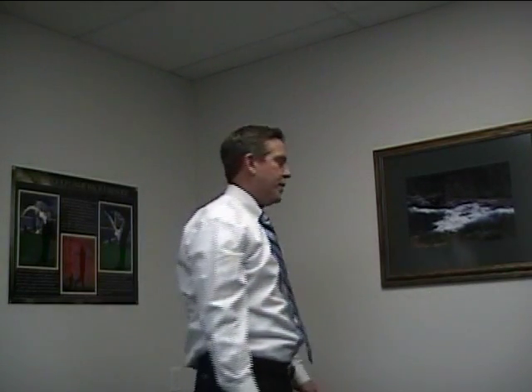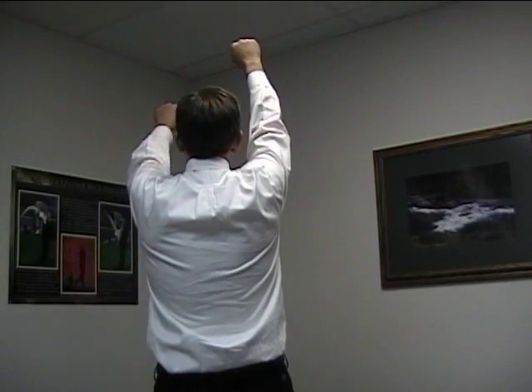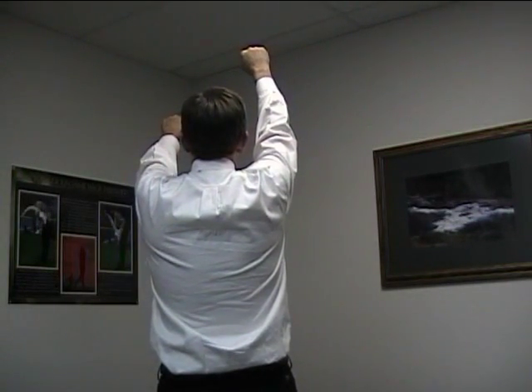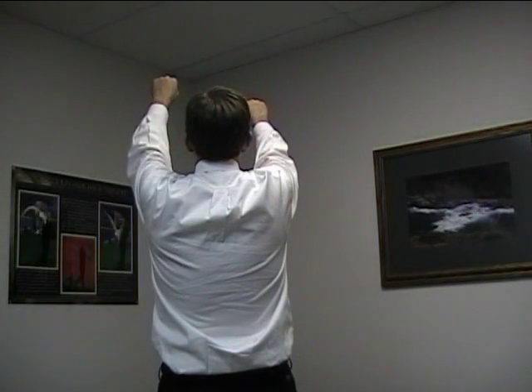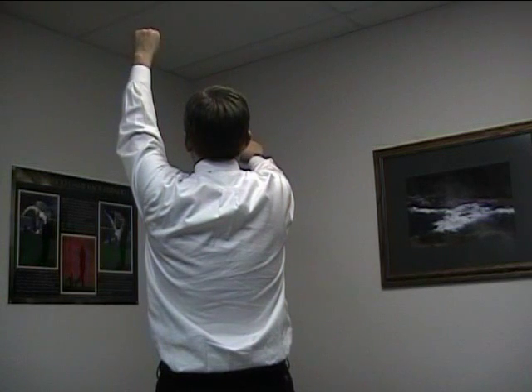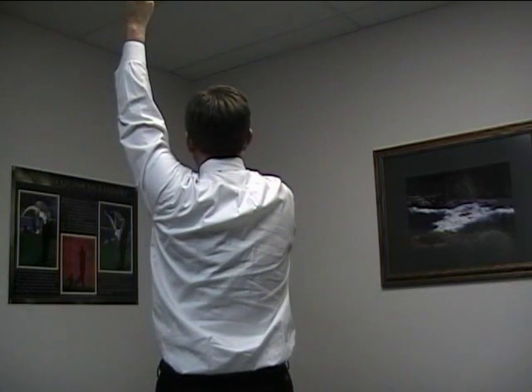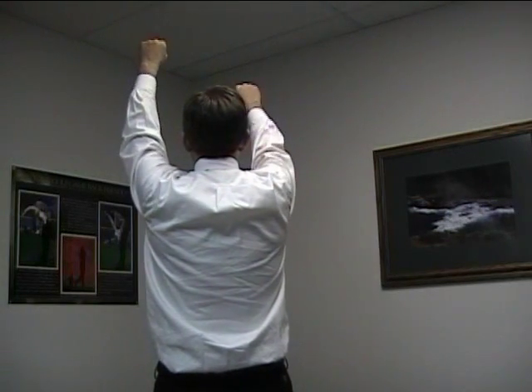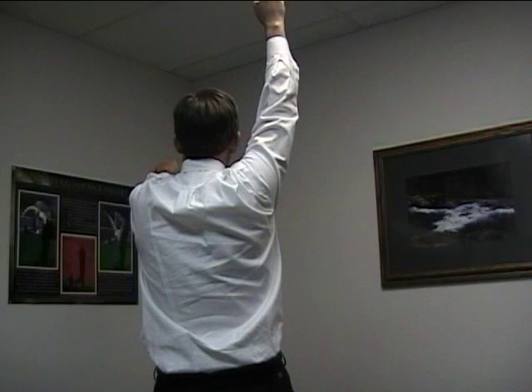On the stretching part of the shoulder exercise, you'll start in the exact same position, but the difference is that as I pull down, I'm actually relaxing my arm going up so that I stretch it back, because they're usually limited in their motion. Then I'll pull down with the up arm and let my down arm go backwards again. So it's just opposite movements.